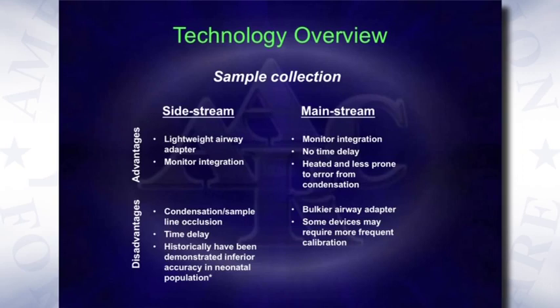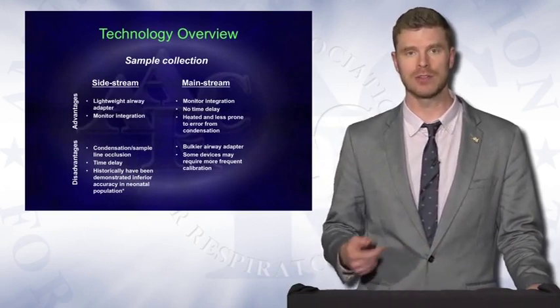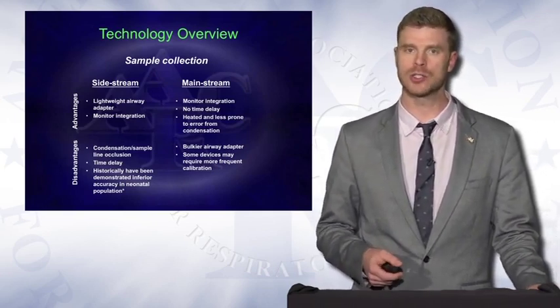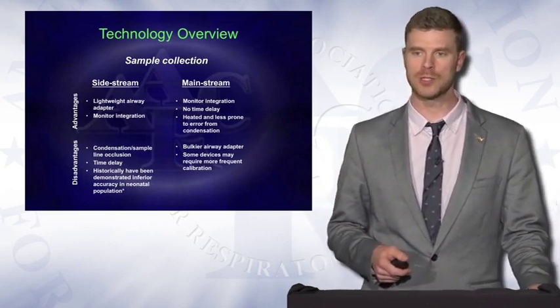For a mainstream device, some devices allow you to integrate with your physiologic monitor. There's typically no time delay. That is, there's no delay between the patient actually exhaling and exactly what you're seeing on the monitor, which can be advantageous in some circumstances. And it's typically heated and therefore less prone to error from condensation or secretions basically building up in the airway monitoring window.